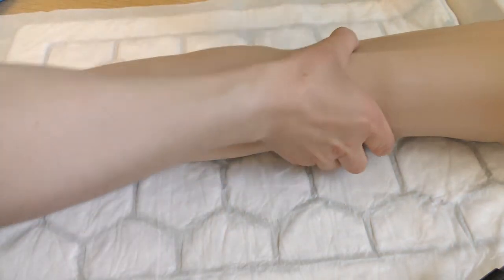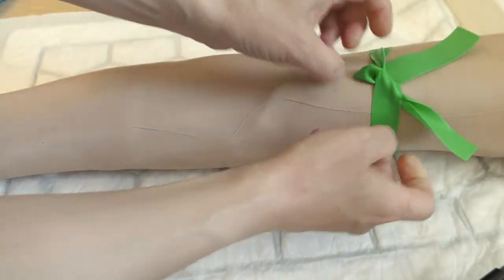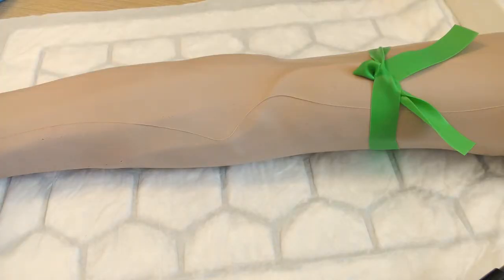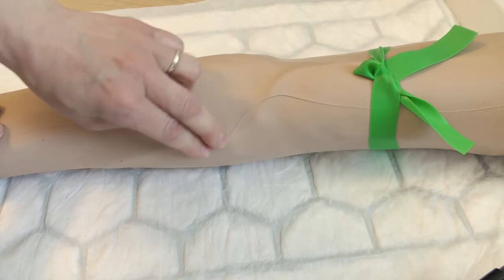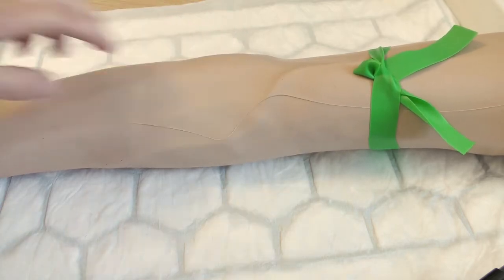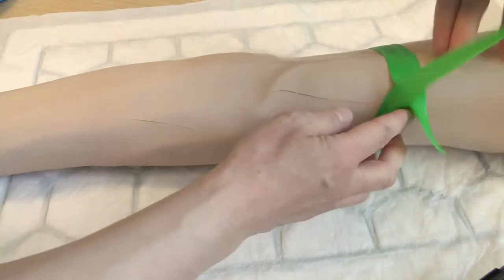Apply the tourniquet and palpate to find a suitable vein in the antecubital fossa. Once a suitable vein has been located, release the tourniquet.